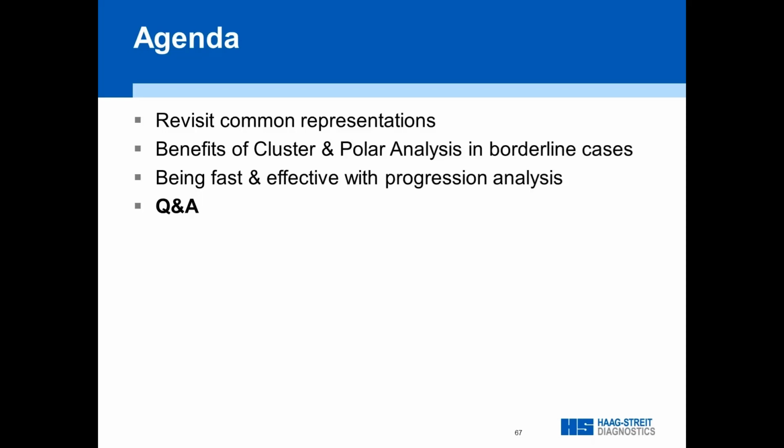And it really depends on the patients. If you have very attentive patients, you may get slightly better results with the dynamic, but if you don't, you may actually get better results with the top. So I really can't say either or. I know very well-known clinics using top, and I know very well-known clinics using dynamic. But definitely your patients will like you if you use top. And if they perform better in the test, you actually may end up with better results.